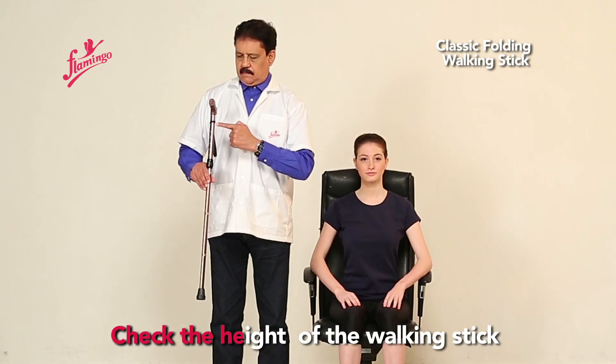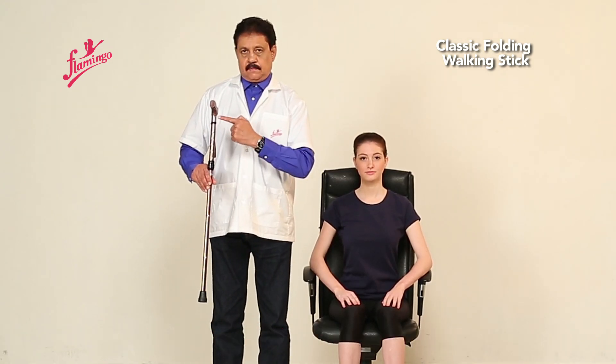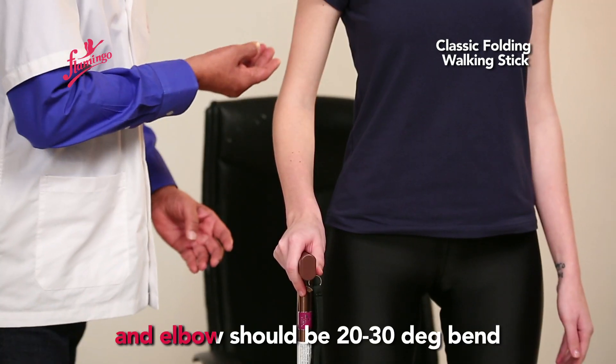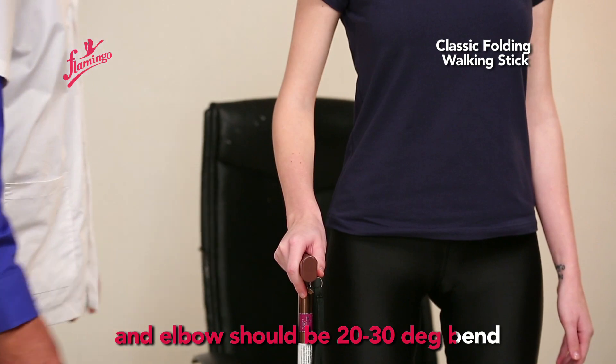Check the height of the walking stick. Ideally, the walking stick should be at the height of the hip bone and the elbow should be at a 20 to 30 degree bend.